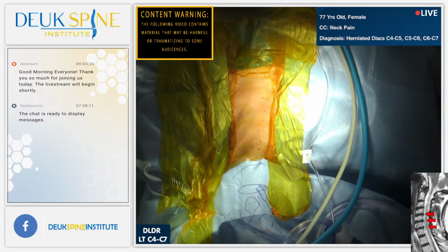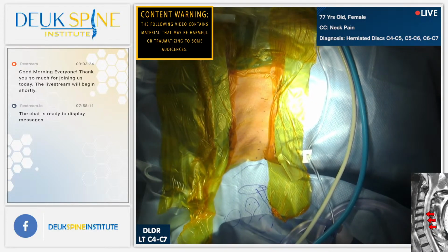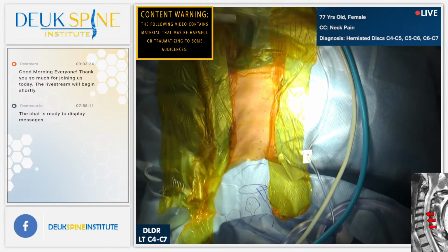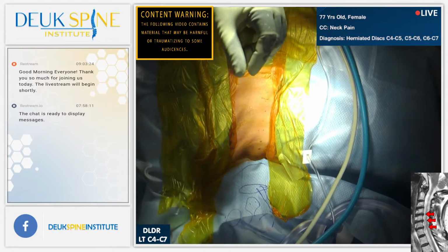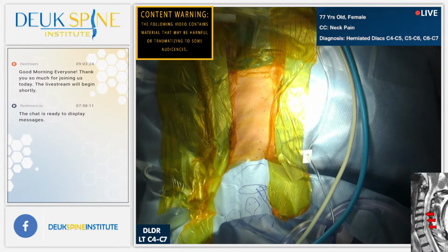So my goal is to get in to the spine, and since we're doing 3 discs today, we're doing number 4-5, 5-6, 6-7. Everybody agree? We want to start over the middle disc. That means it's the center of the surgical field. Okay, the C5-6 disc is what I want to target. Upon entry, we're going to try to do all 3 discs with 1 incision. That incision will be 4 millimeters, and I'm going to fix 3 discs with one single 4 millimeter incision.